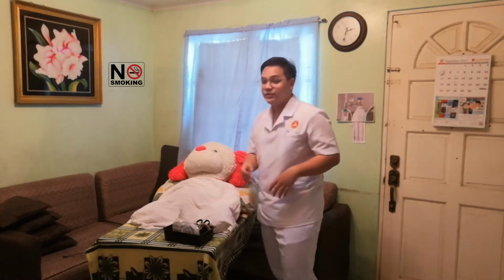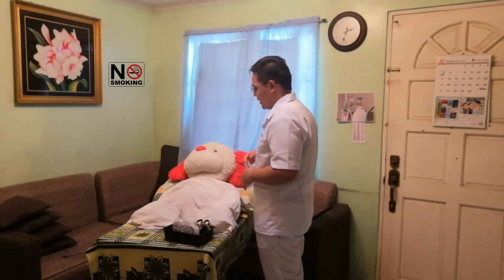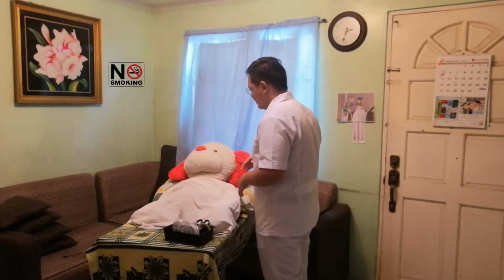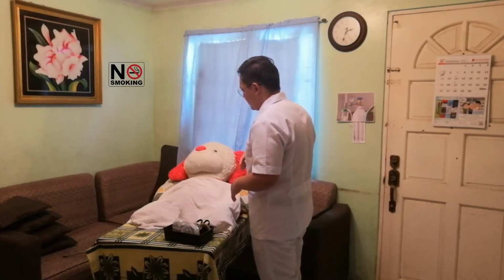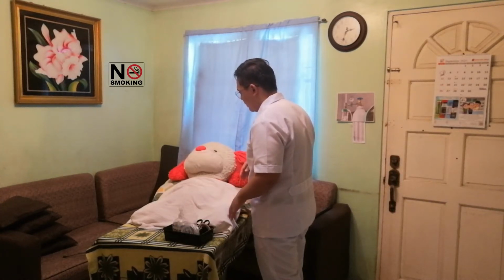Okay. And now we will be explaining the procedure to our patient. What are we going to do and why is it necessary? Okay, and if the client can cooperate. So for today po ma'am, mag-a-administer po tayo ng oxygen administration, or oxygen therapy. So, ang gagawin lang naman po natin is I will be inserting po a nasal cannula po sa inyo pong nares or sa ating pong ilong. And that is all po. So you may feel a little bit of discomfort lang po upon inserting po yung ating pong outlet prongs. Okay lang po. So will you cooperate with me po?